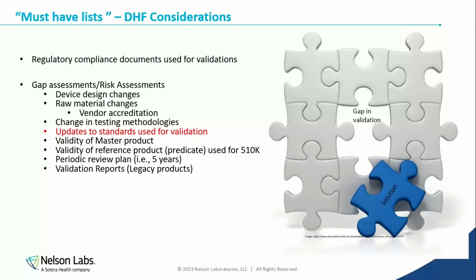Back in the day, I remember when I started in 2003, when we used to get validations, we only did steam sterilization. We didn't do cleaning, because cleaning was just a little paragraph that said follow hospital practices for cleaning of the device, and then steam sterilization you would have to validate. So that was back 20 years ago. And so you can just imagine that 20 years ago, we left our instruments to be cleaned by healthcare facilities, and today we have stringent validation criteria for cleaning validations. So we have changed a lot. And in between, as I go through the presentation, you will see where those changes have happened.